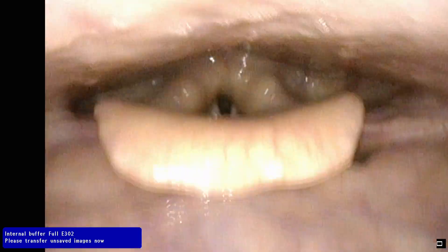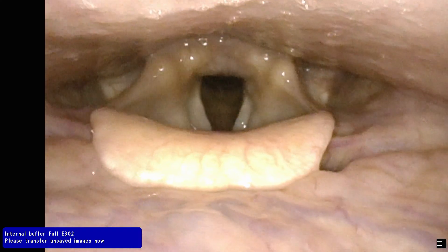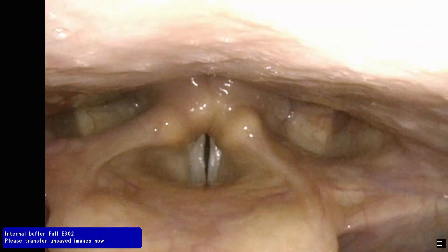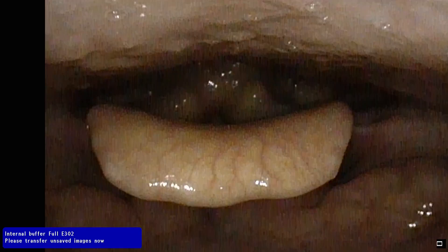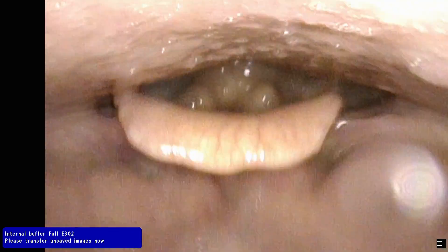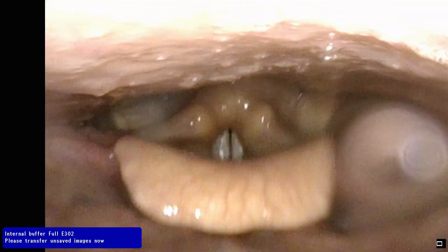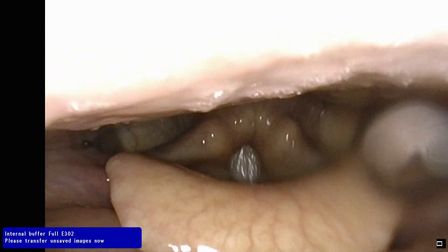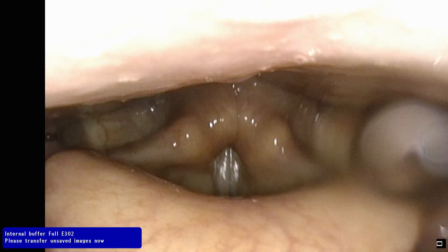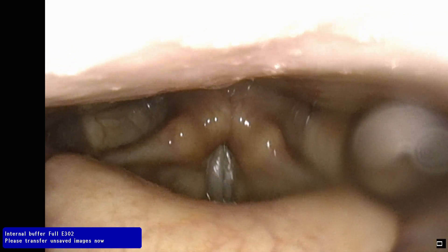This is in the front right here, and this is the back — so that's the back, yep. Maybe could I — I don't know if it would be helpful if you're already seeing what's happening, but maybe if I try doing something a little more strenuous. And also, like, when I'm speaking and I hit vocal fry — like this — what is happening with that? Yeah, so kind of hold down — okay, so see how those vocal cords there, did you see how they were vibrating like that?